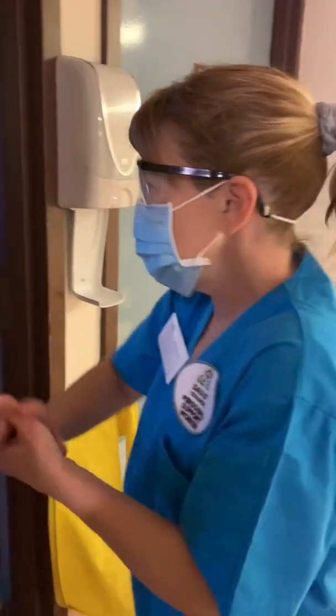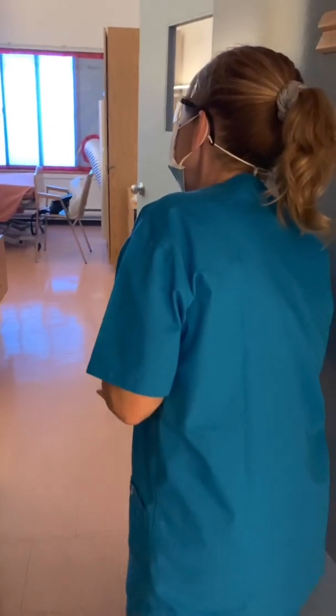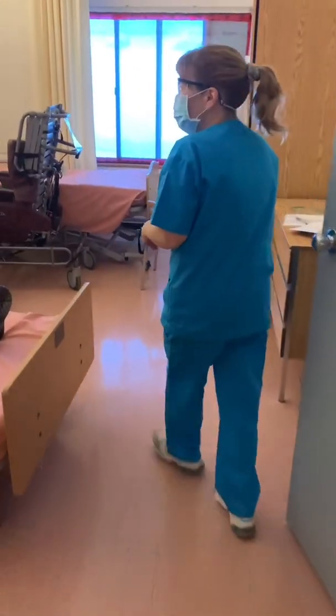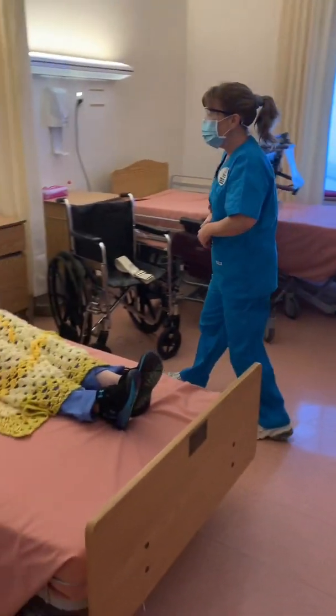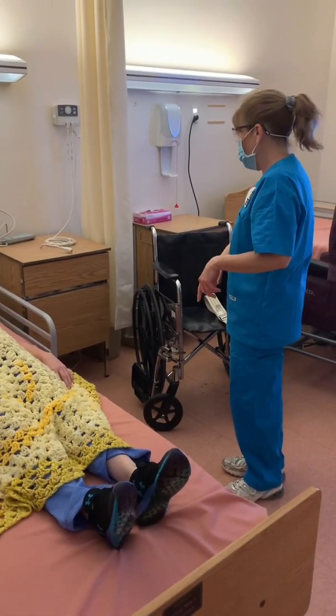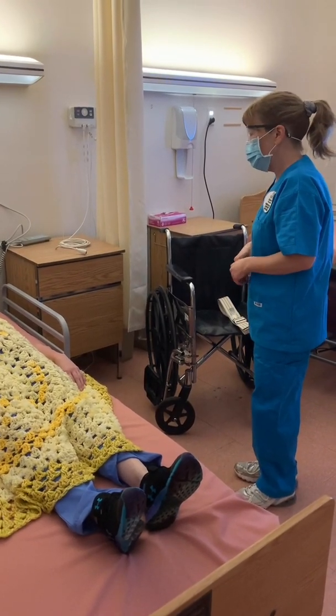Okay, we're ready? Good morning. May I come in? Good morning, Tina. I'm Eleanor. I'm your personal carer this morning. I'm going to help you transfer from your bed to the wheelchair so that we can bring you down to the dining room for lunch. Would that be okay with you?